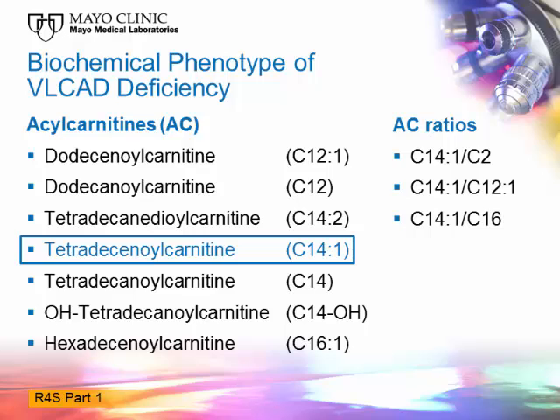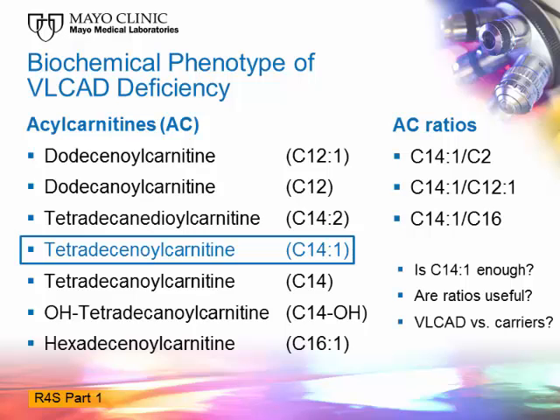Despite the opportunity to rely on 10 different markers, there is no consensus on the proper way to interpret these results, and conflicting views based on expert opinions are abundant in the literature. Today, the debate over using more or less markers, the utility of calculating ratios, and especially what to do to segregate affected patients from carriers continues with persistent intensity. This is exactly where R4S comes in.